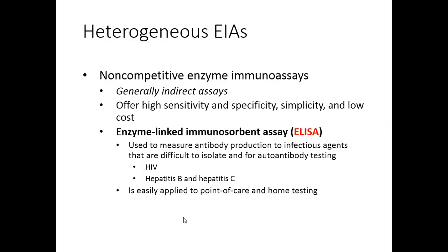We are not looking again for the antigen itself, HIV, hepatitis B or C, something like that that's hard to detect, and maybe in very low quantities. It could be hard not just to detect, but to identify it in a sample. So we don't look for it. We look for the antibodies to that, right? We're going to look for the indirect product of the immune response against those things.